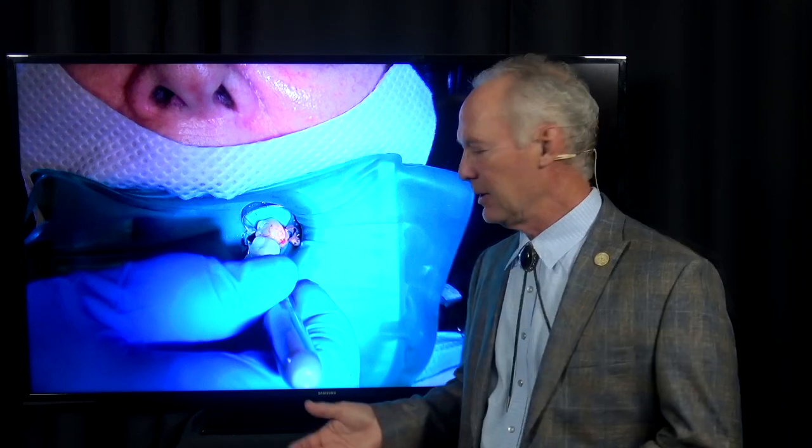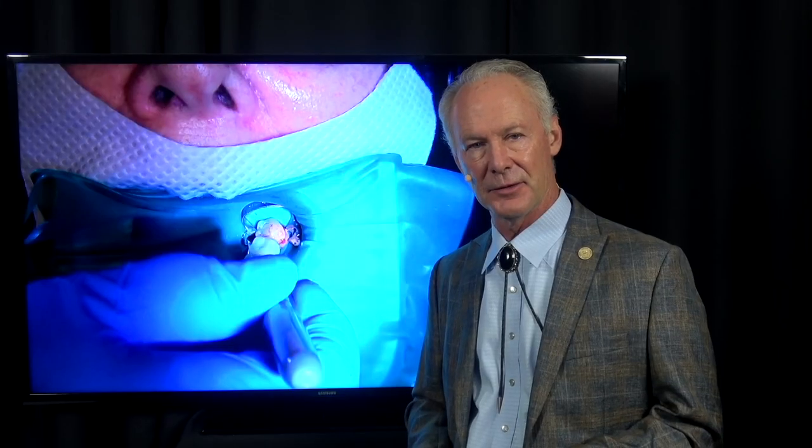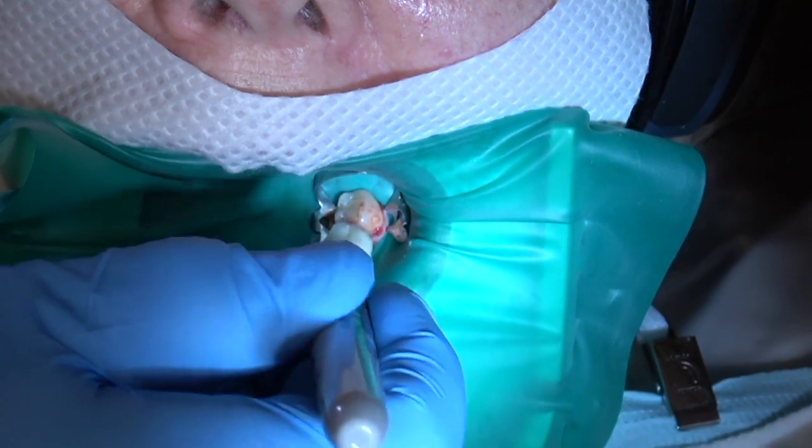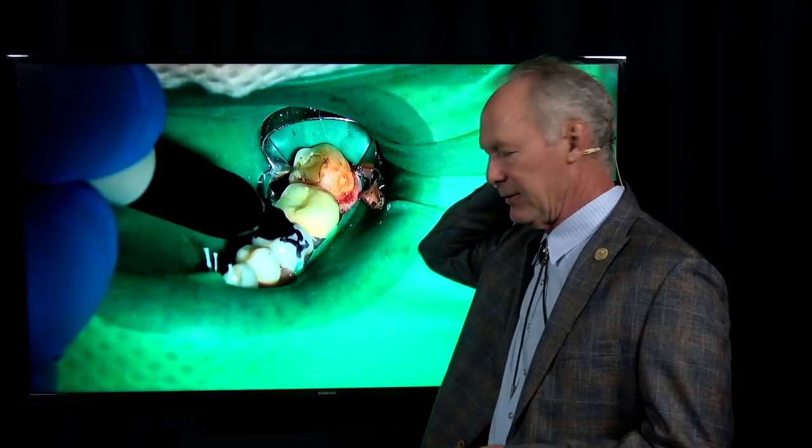The patient really likes it too because it keeps 99% of the water out of their mouth and they don't have to worry about a piece of something being aspirated. Now when I'm extracting a tooth I mark it. In 40 years I've never taken out the wrong tooth, but don't take a chance on being confused. So I mark it with a magic marker and have my assistant read the chart — Louisa, which tooth are we extracting? I don't prompt her; before I put the mark on it I want her to tell me.